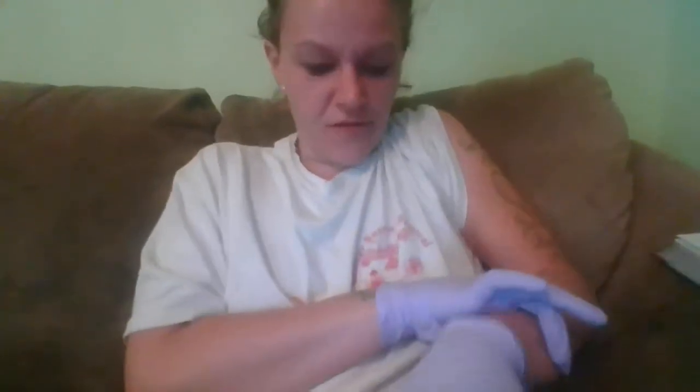Okay, so you'll want to apply the tourniquet about 3 inches above the area where you're going to be doing the blood. If you can't get a good vein right here, maybe the person's dehydrated, their veins might have gone flat, or could be rolling and just giving you a hard time, then I would put it about 3 inches above the wrist to try and get a vein in the hand.